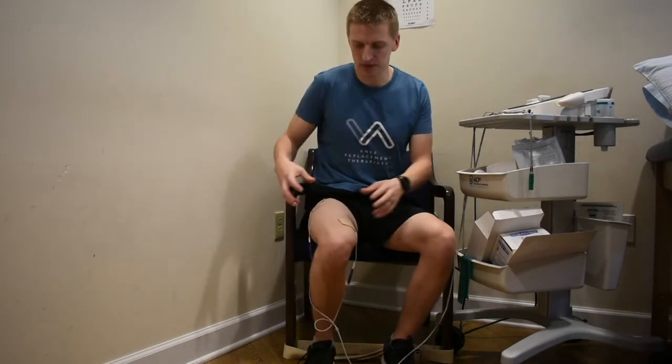NMES, or Neuromuscular Electrical Stimulation, is using electrical stimulation — electrical inputs through pads — to provide a strong, firm muscle contraction. It's used particularly after knee surgery with your quadricep muscles of your thigh, muscles that are very commonly atrophied and weakened after surgery.